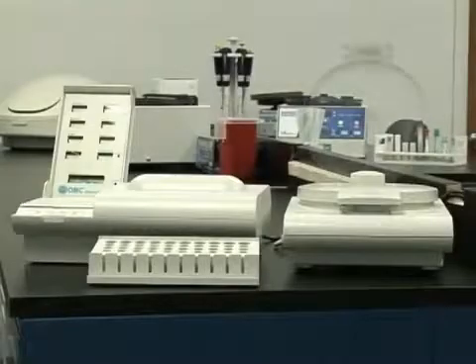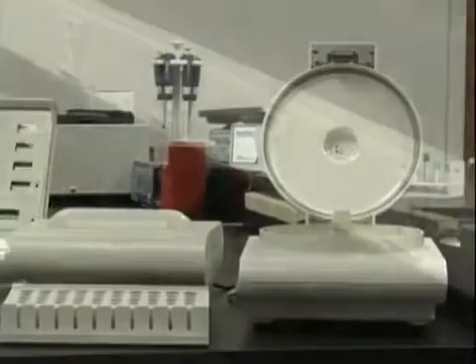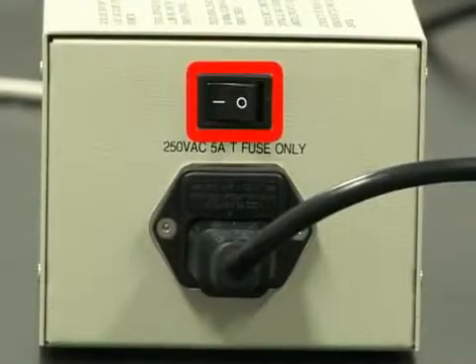Centrifuge operation. In this section, we will examine centrifuge operations. A safety note: make sure to plug in the centrifuge before turning on the power pack.